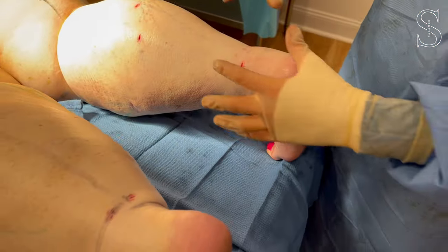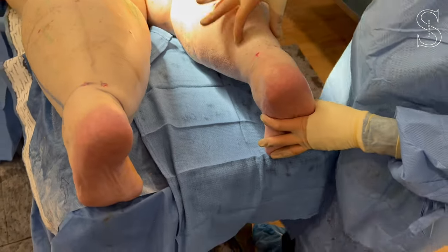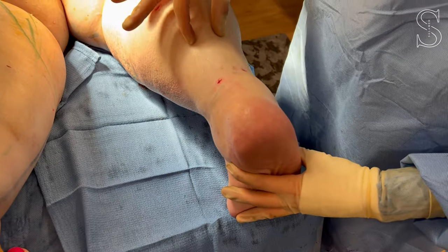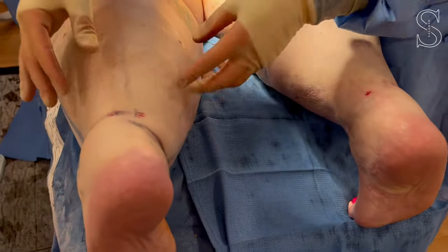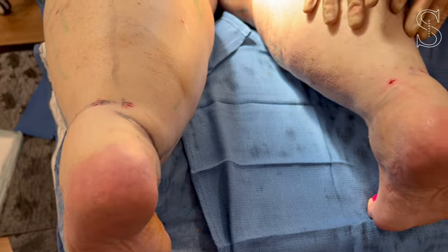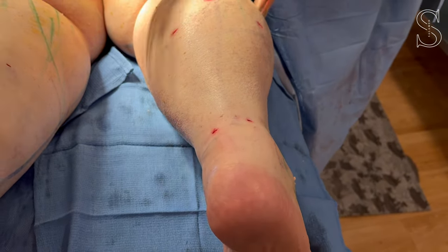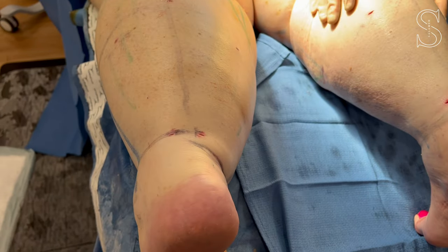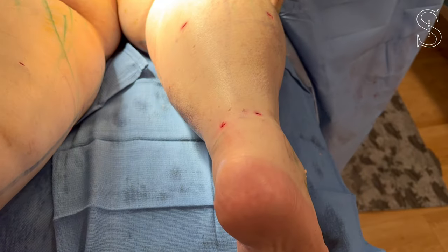We just finished 360 lipo on our patient's right leg, and take a look at the difference. If you look over here, you see the Achilles tendon here. Compared to the other side, look at the difference, it's impressive. Obviously, this side is untouched and this side has had liposuction. And look at that. It's like this leg belongs to a different person. Look over here and look over there. She's stage 4 lipedema and lymphedema, and look how awesome she's looking.